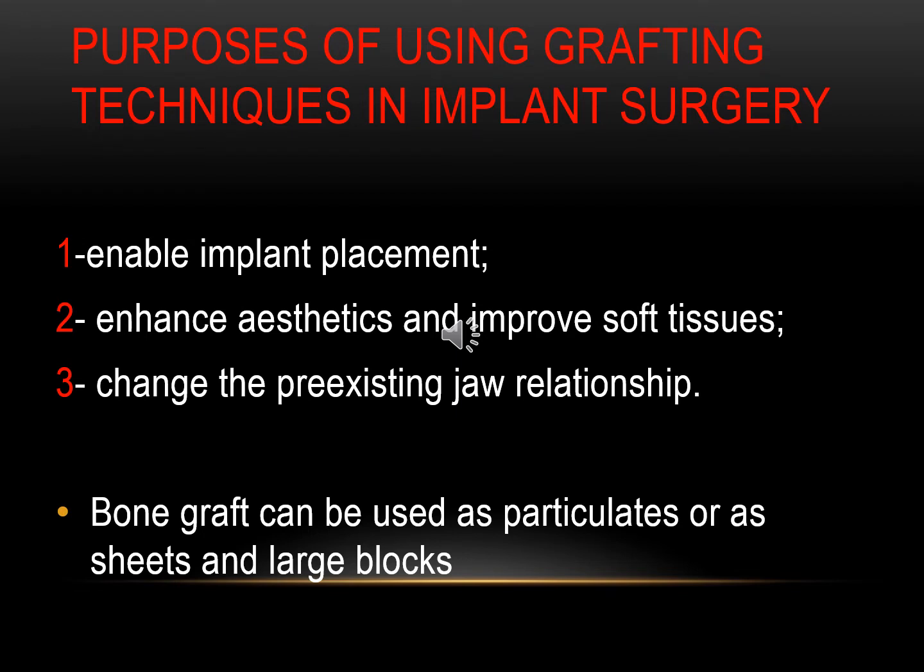Bone graft usually can be used as particles or powder or sheets or large blocks.